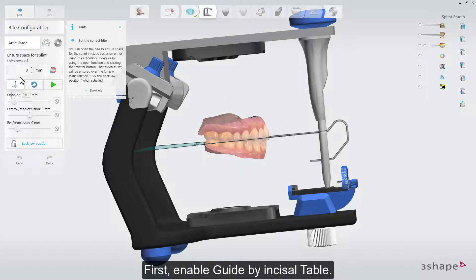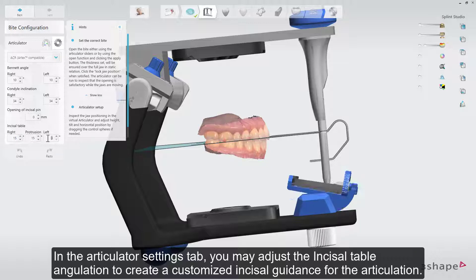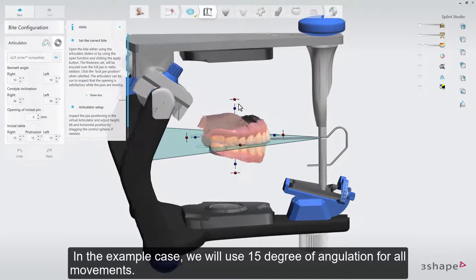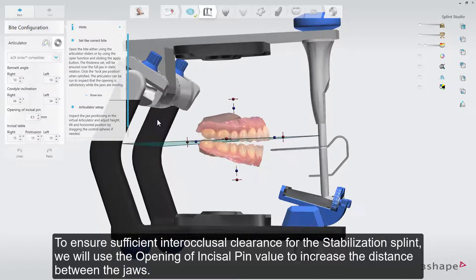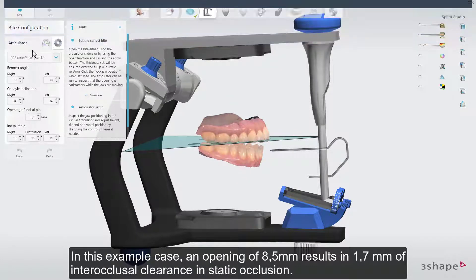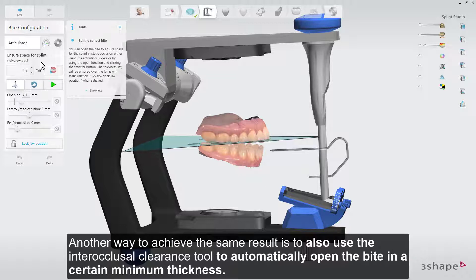In this case, we will adjust the virtual articulator settings to help produce the anterior guidance ramp for the splint. First, enable Guide by Incisal Table. In the articulator settings tab, you may adjust the incisal table angulation to create customized incisal guidance for the articulation. In the example case, we will use 15 degrees of angulation for all movements. To ensure sufficient inter-occlusal clearance for the stabilization splint, we'll use the opening of incisal pin value to increase the distance between the jaws. In this example, an opening of 8.5 mm results in 1.7 mm of inter-occlusal clearance in static occlusion.